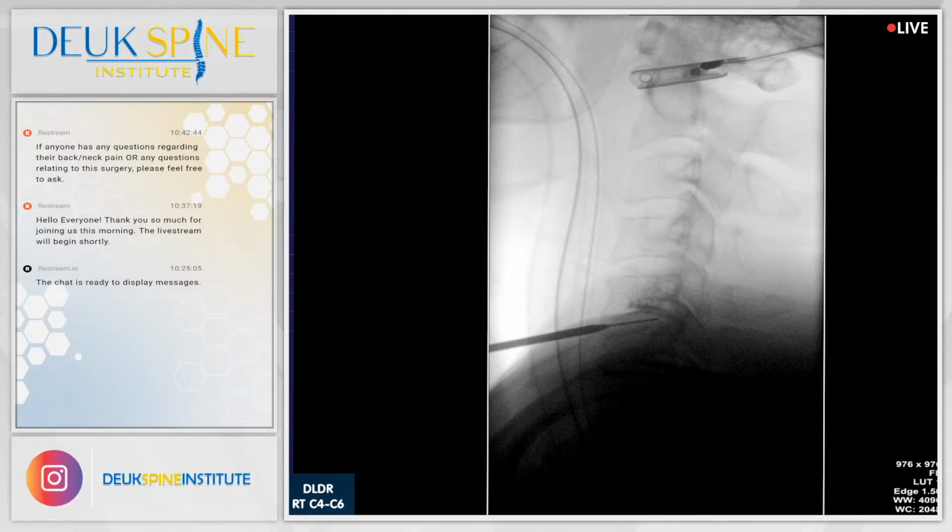We're going to go in there and clean that tear. The procedure is called the Deuk laser disc repair. Now, the alternative would be a fusion, ACDF, or an artificial disc.